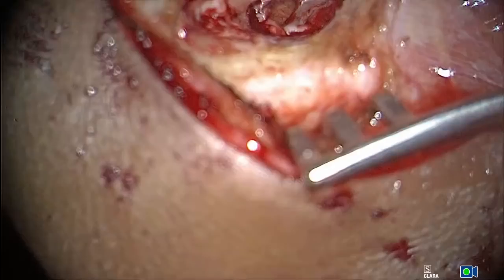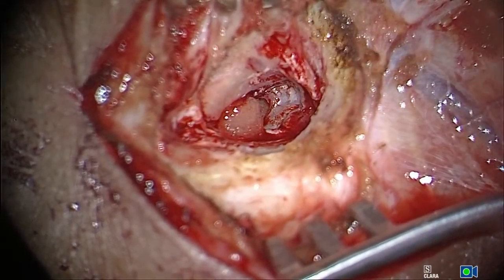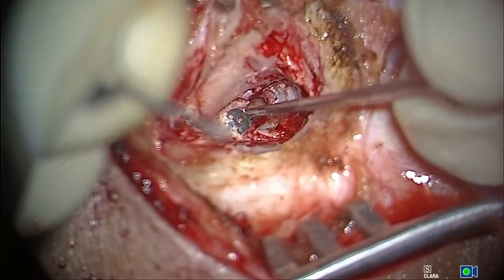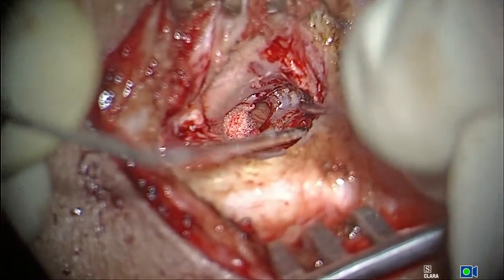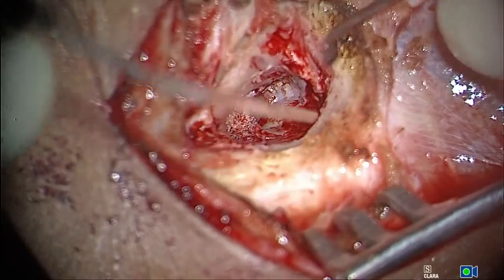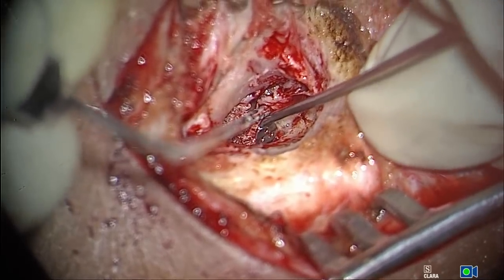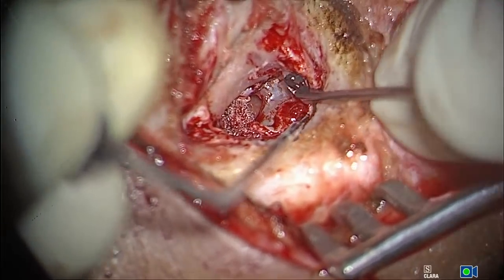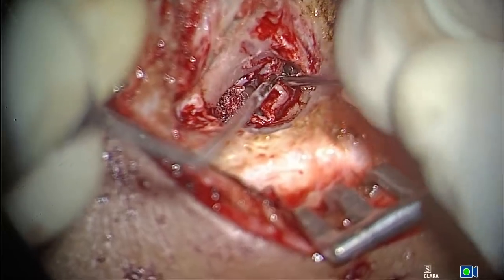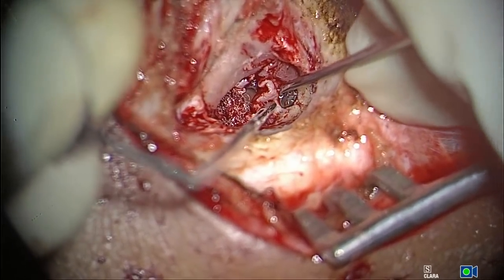Now what I'm going to do is to go for the posterior elevation. Keep that cotton ball there. Flap. And now I'm going to make that. Give me a knife. That is the posterior flap. You can see that very, very beautifully. Going towards the annulus. So that's the tympanosquamous suture line. See, I don't think it's going to obstruct my view. I don't have to do anything big for that right now.